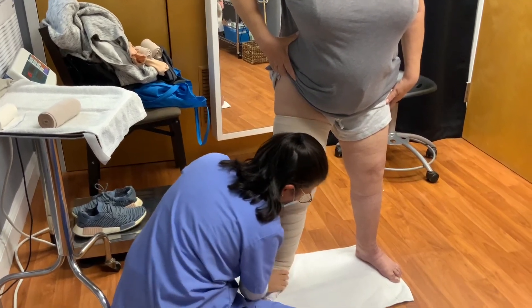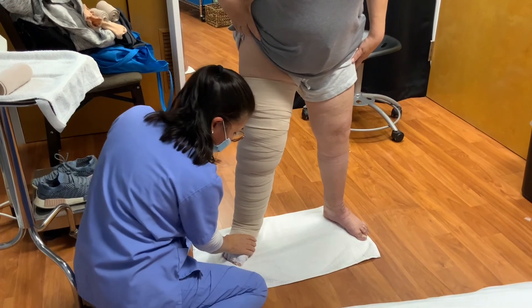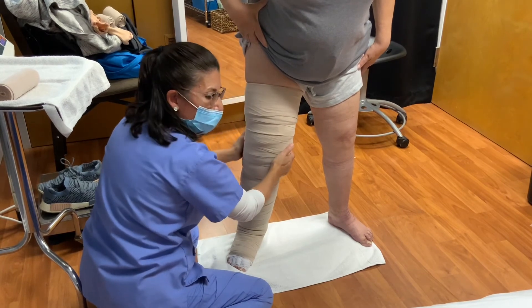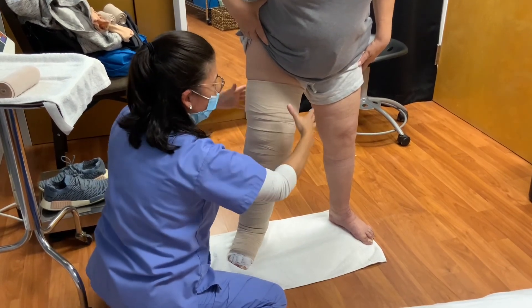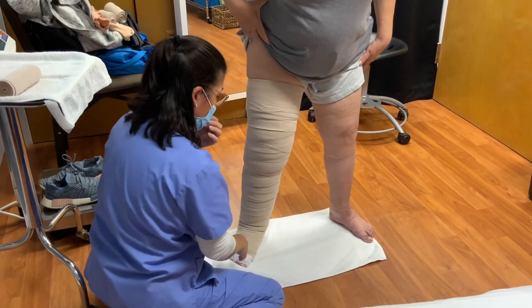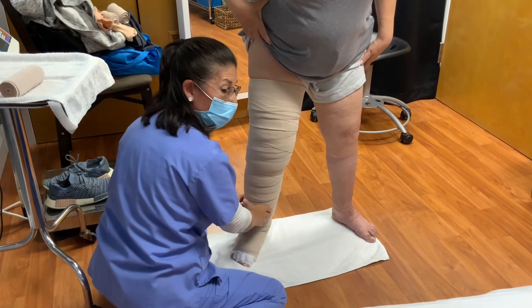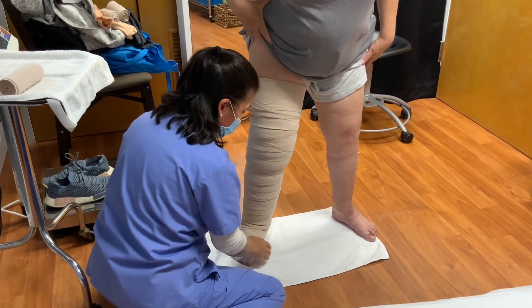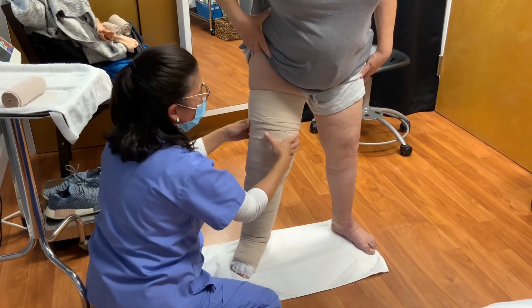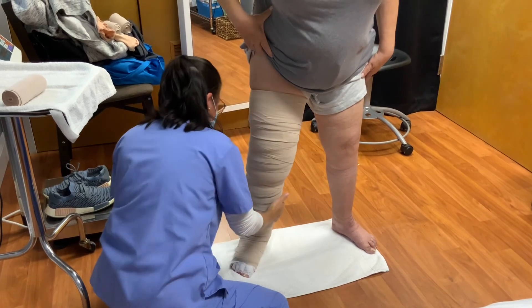Now you want to check for consistency. You want to make sure that it's firm at the foot and the lower calf, and a little bit more mushy as you go up. If you notice that it's too tight at the top and loose at the bottom, it's time to redo it — otherwise the fluid can be pushed downward. The idea of multi-layer bandaging is to get the fluid to push up into the lymphatic system so that it can get out of the body.